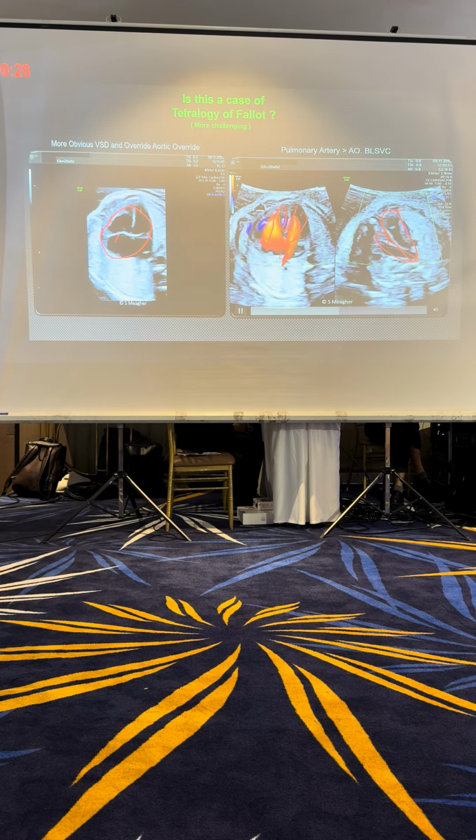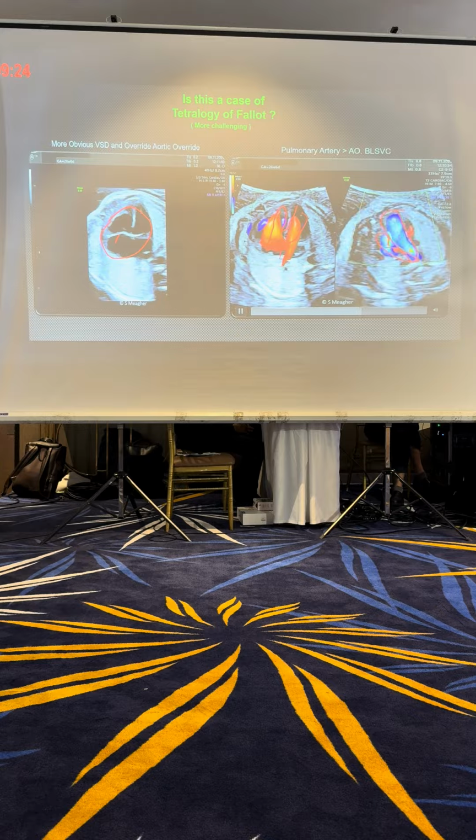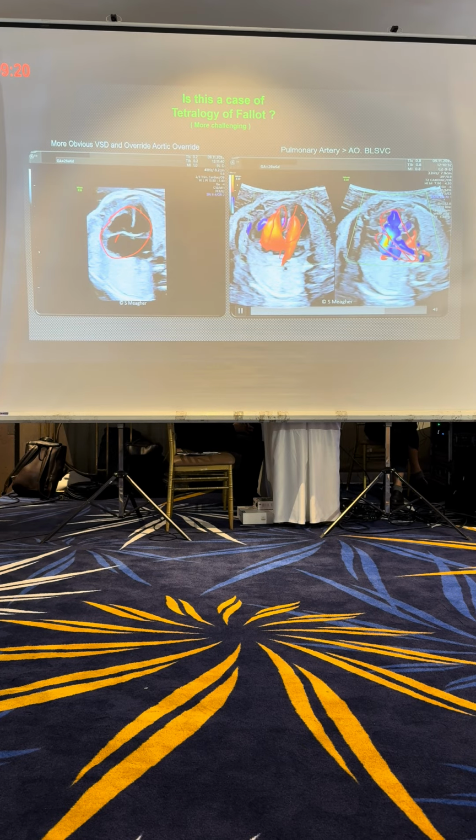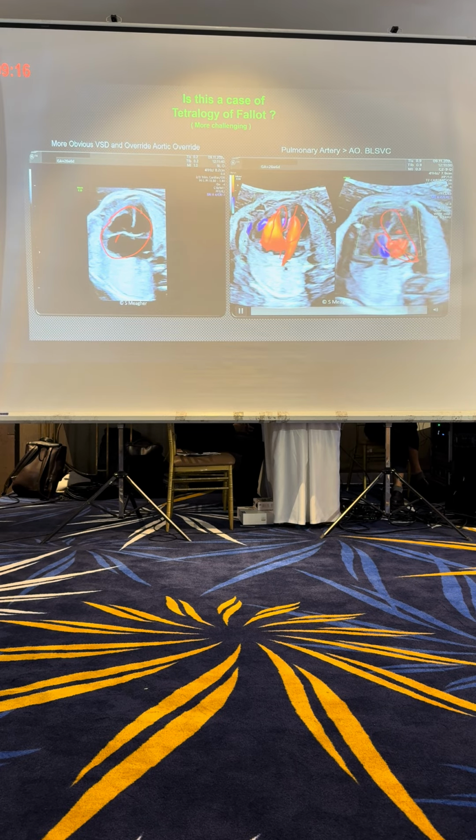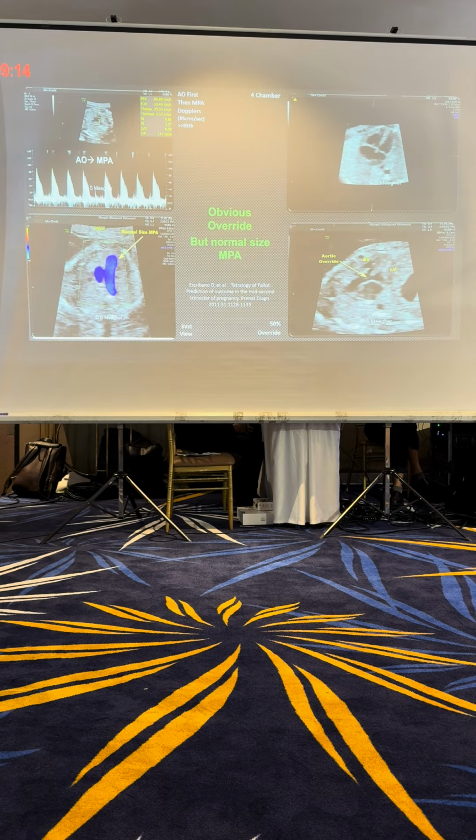And this is the aorta. They're almost identical in size, but it's very clear there is aortic override. If I do a pulse Doppler and it's normal, I will still say wait and see, but I'm much more suspicious about this baby than the previous baby. This baby is the next one, which is getting more and more obvious.